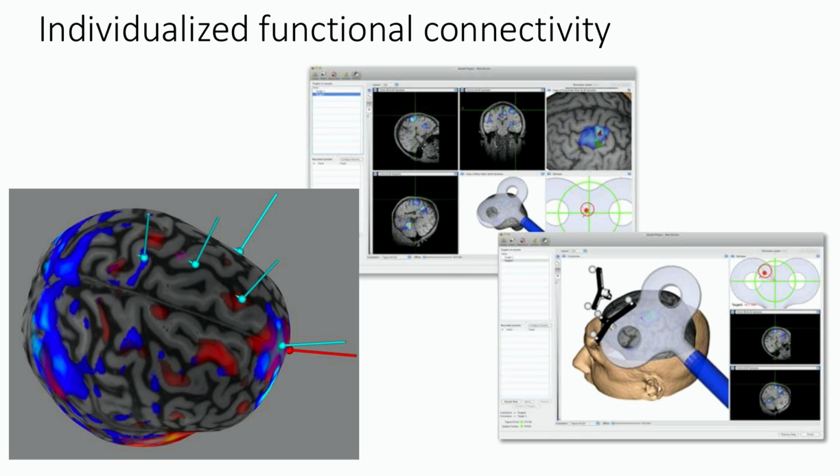And what I do is fairly simple with respect to capturing a good signal. What we do is more like a mapping technique with single pulses. So it's kind of like getting a motor evoked potential in your hand or your finger twitch. So we're hoping to show that distributed circuits are engaged in response to a TMS pulse. And we also at the same time have our own version of fMRI-guided treatment for depression and PTSD. And so we really want to substantiate those and make them work better.